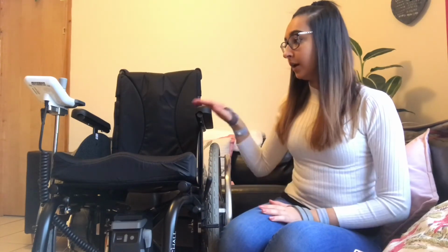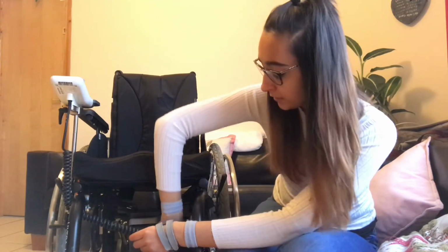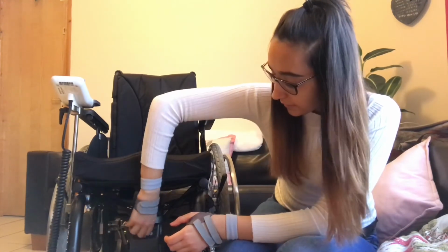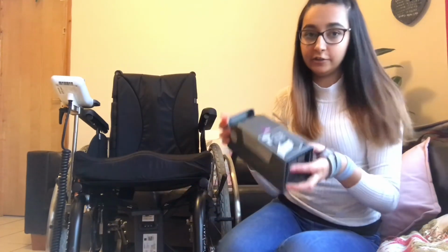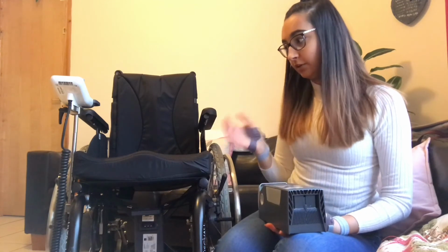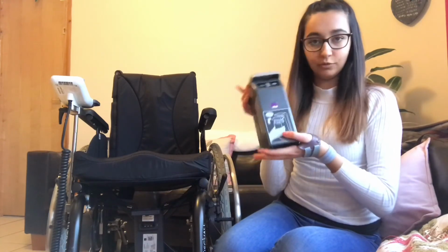Also, I found the battery power to be so much better than the SmartDrive was, and it's really easy to charge. So I'll show you how the battery works because that's also really easy. You've got this magnetic cord and that attaches to the control pad. That's magnetic and it doesn't take a lot of effort to just undo that, and then it's sort of like a button. You can see what I'm doing here, and then the battery comes out and then you can just charge this. So if you're keeping your wheelchair in an awkward place, like the boot of a car, you don't have to take the whole wheelchair in and out. You just take this and then that will just charge, with a charger in the wall.